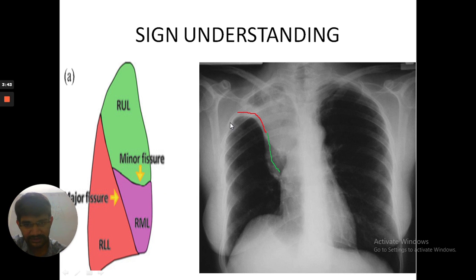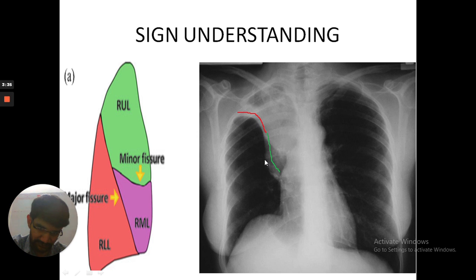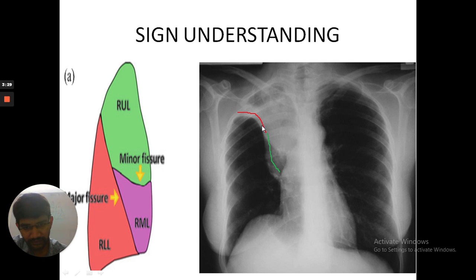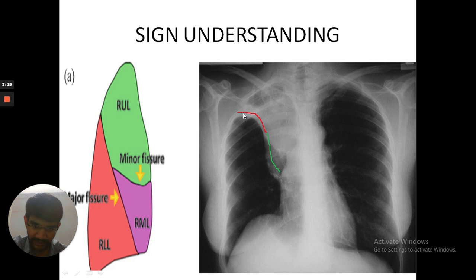But in Golden's sign, come to the image on the right side of the screen. As you can see, there is an S-sign or a reverse S-sign here — this is known as Golden's sign. The red color portion is concave inferiorly and the green color is convex inferiorly, representing the minor fissure.